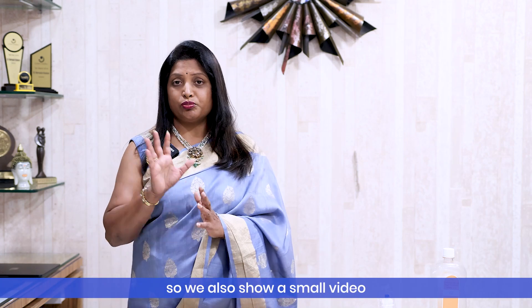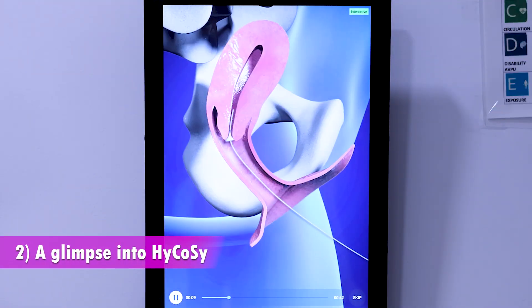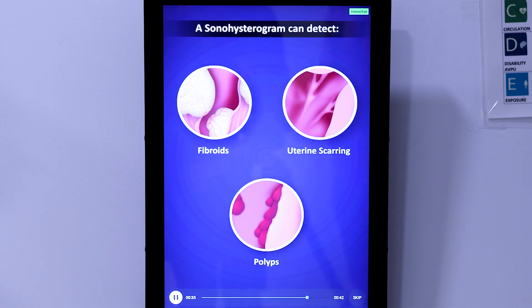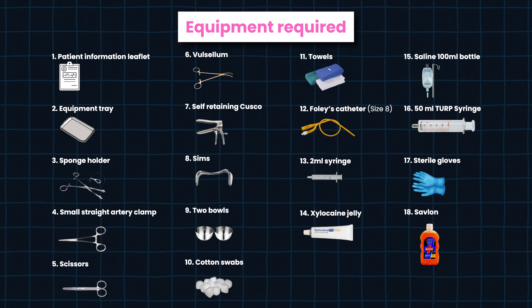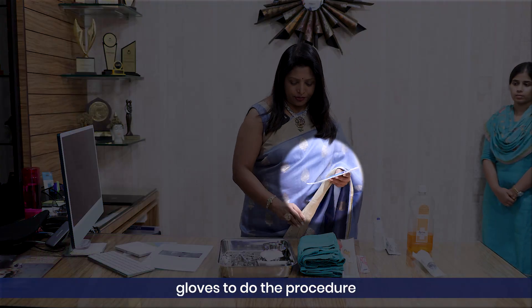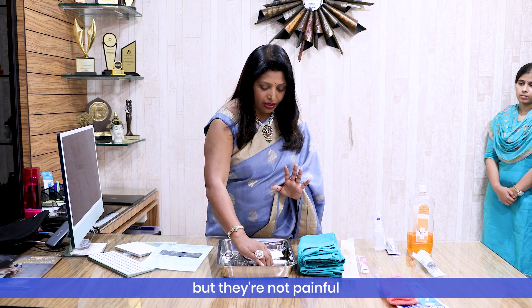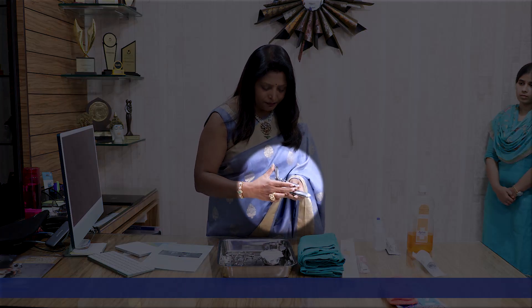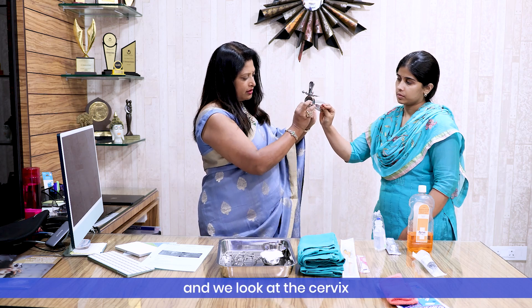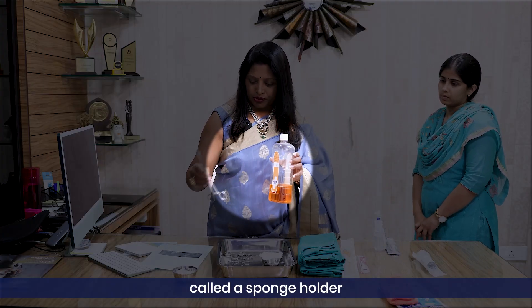We also show a short video about HyCoSy, and after all that is done we come to the procedure. We need sterile gloves — we wash our hands, dry them, and use sterile gloves — and then we clean the lady. One instrument is a small speculum; we use this to open the cervix. We insert it gently and open it to visualize the cervix, and then we clean with an antiseptic solution using a sponge holder.